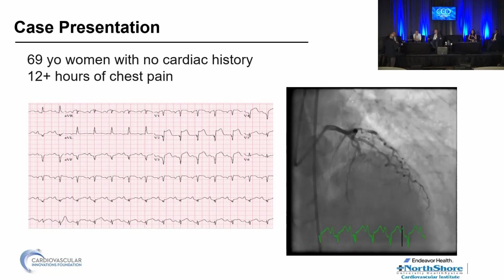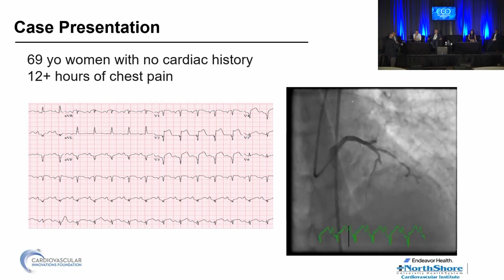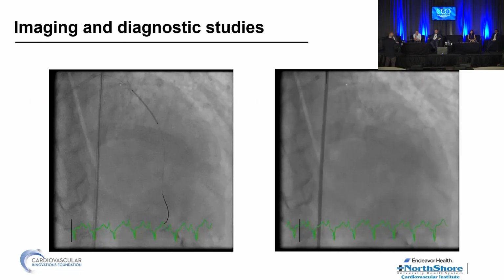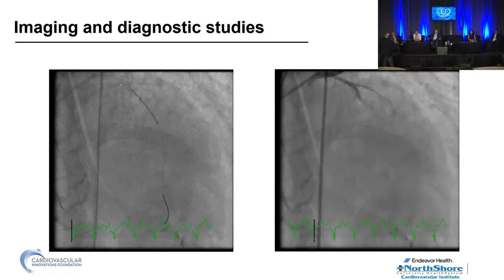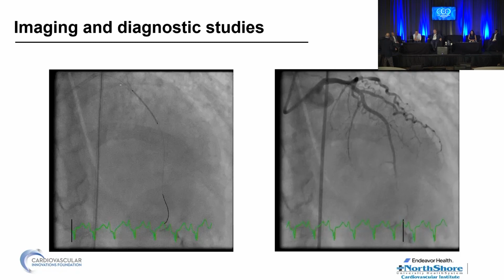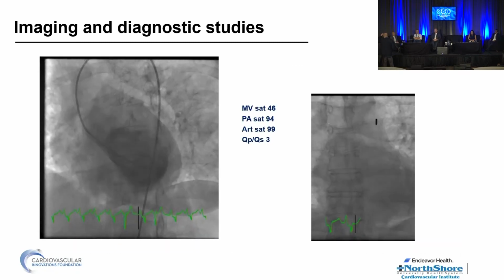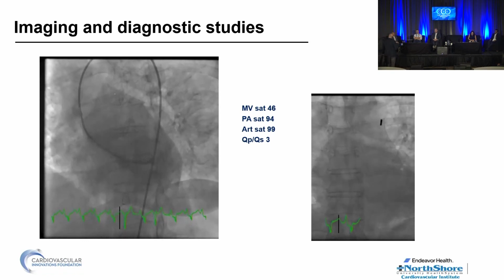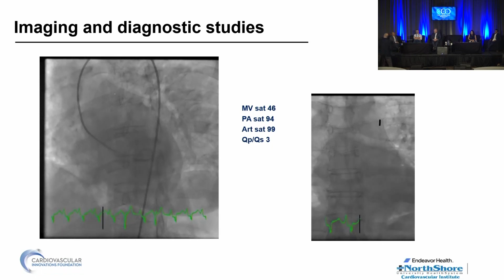A 69-year-old woman presents. I think I did this diagnostic, I'm not sure, but it was a while ago now. Late presenter infarct. LAD is down, stented. Funny flow, something might be wrong here. Late presenter, first infarct. I still know how to do a ventriculogram, I do about one a year. And the hemodynamics are there, pretty significant. She wasn't sick, but a little sick, so we put a balloon pump in her.